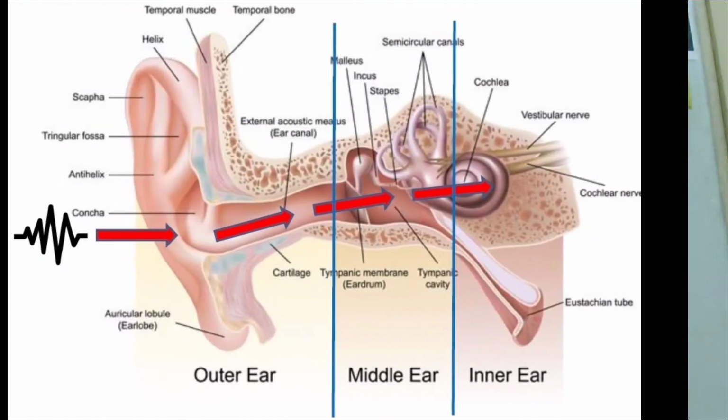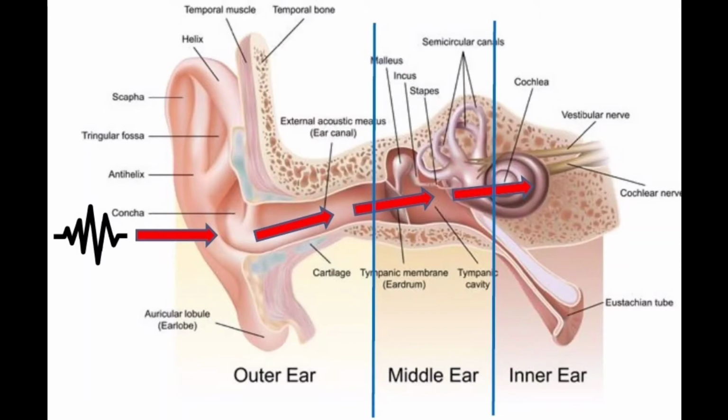This is an ear mechanism picture. Headphone is used to analyze hearing loss level. When the assistant gives the tone, the subject will press the button when they hear the tone sound. Headphone is used to examine the left and right ear.